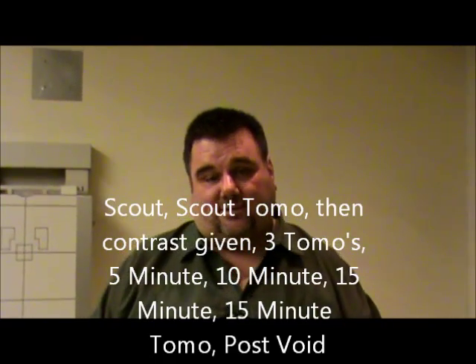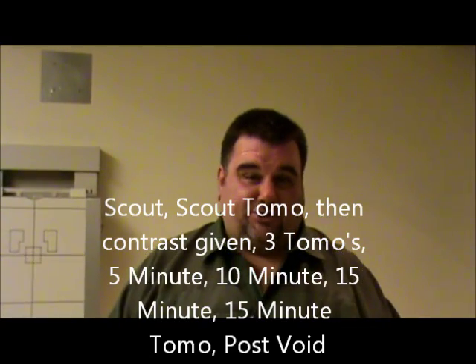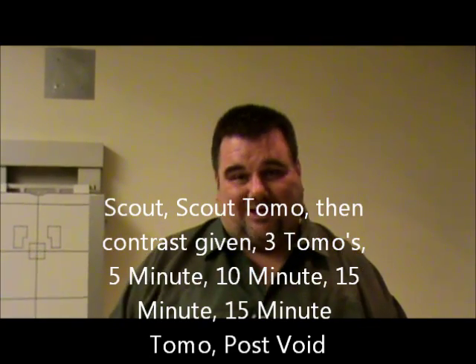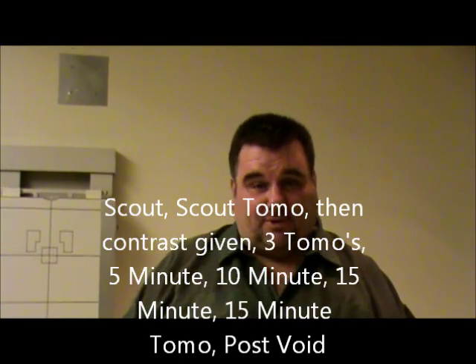Today we're going to be demonstrating an IVU — sometimes called an IVP, but we refer to it now as an IVU. The routine views we're going to demonstrate are the scout, the tomo scout, and then after the patient has been injected with contrast, we'll do three tomograms. We're going to measure with the caliber, and that's how we determine what cuts to do on our tomograms.